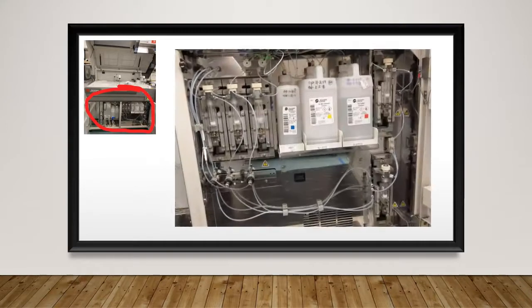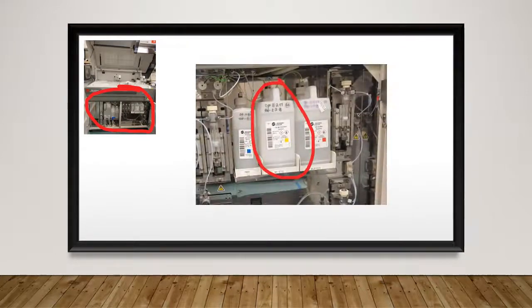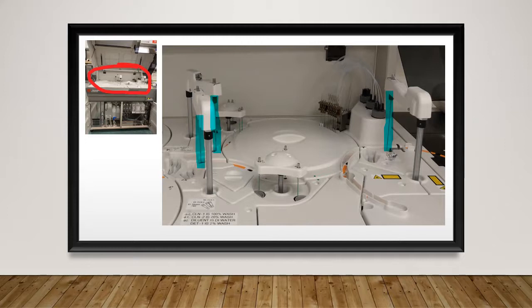Let's begin by visually inspecting all syringes and tubings for leaks. Now check the bulk reagent supplies and storage tanks for leaks. Remember to replenish or refill depleting supplies as needed. Now let's open the analyzer cover and continue the maintenance by visually inspecting all probes for wear and tear.